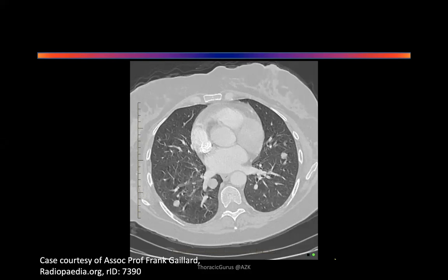This is a non-contrast enhanced CT scan of chest, and there are multiple small circumscribed nodules present in bilateral lung fields, and there is some evidence of fibrotic changes in both the lung parenchymal fields as well. And I can see multiple chambers of the heart in this view. There are a couple of small lesions present in the peripheries, and there is one abutting the left pulmonary vein as well. So right pulmonary vein as well.